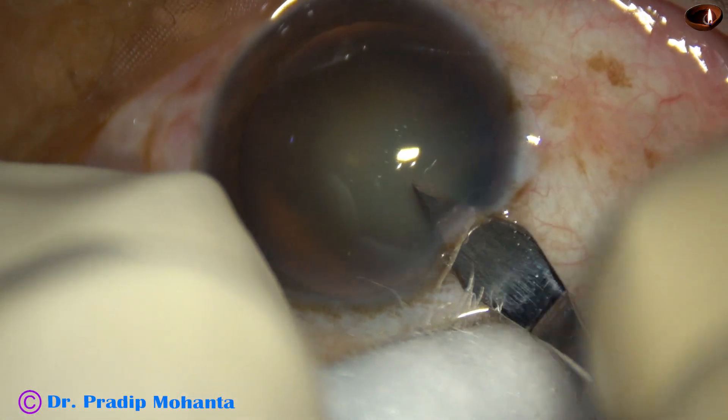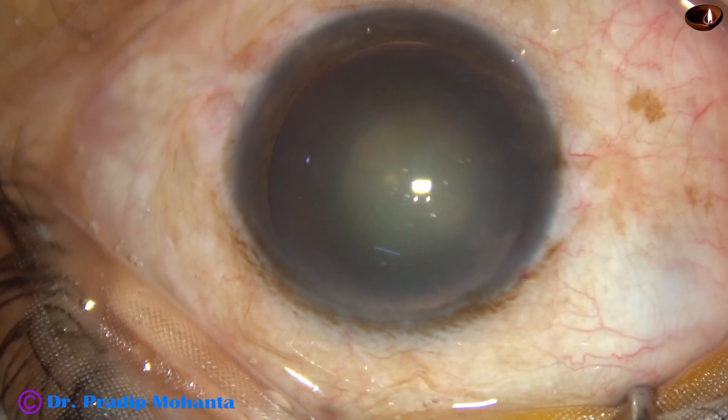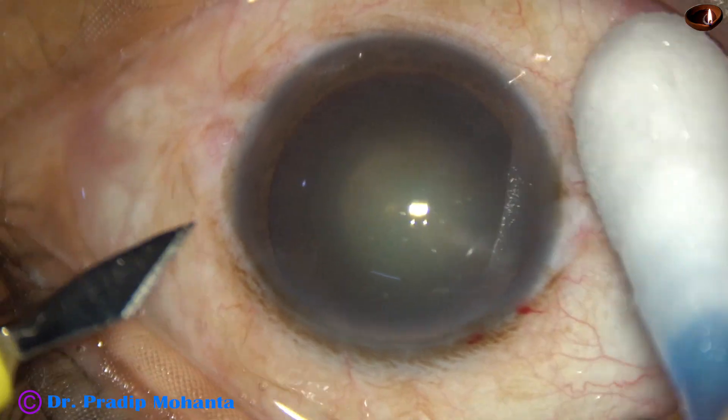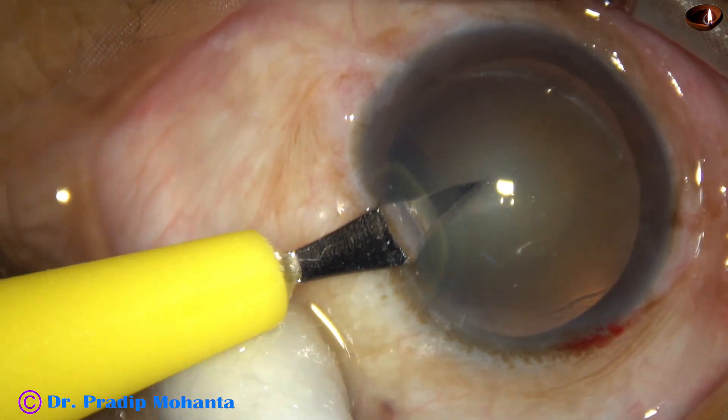This is the main incision with a 2.8 mm steel keratome. And now, this is a side port on the left side of the main incision.